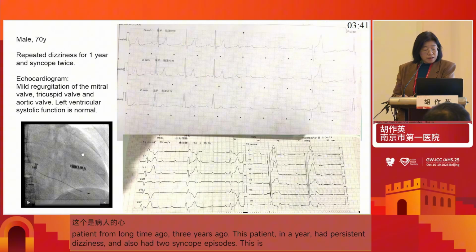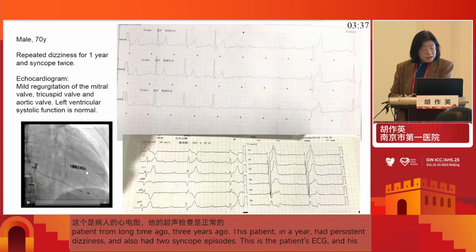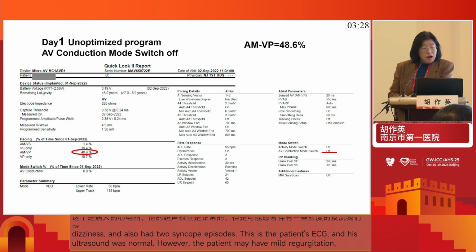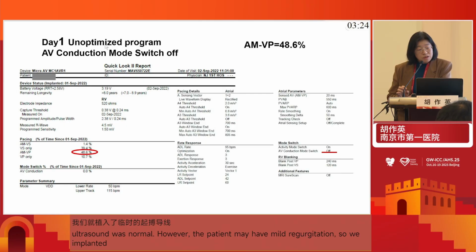And we implanted the Micra AV, this leadless pacing device. And after implantation with just the automatic programs, the AV conduction mode switch is off.